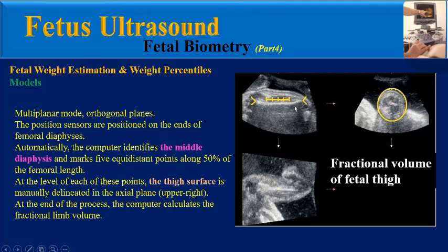The sensors are positioned on the ends of the femoral diaphysis. Automatically, the computer identifies the middle diaphysis and marks five equidistant points along 50% of the femoral length. At the level of each of these points, the thigh surface is manually delineated in the axial plane. At the end of the process, a computer calculates the fractional limb volume.